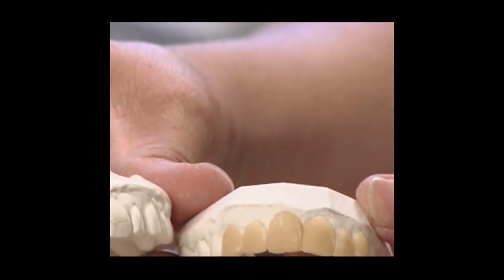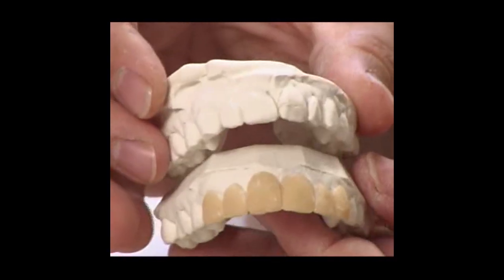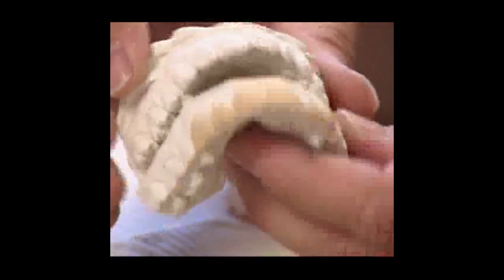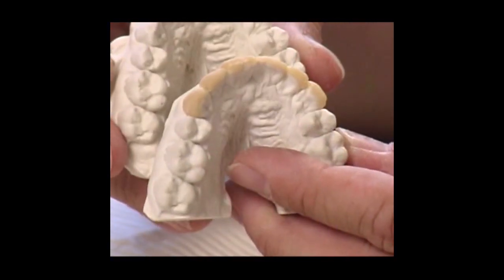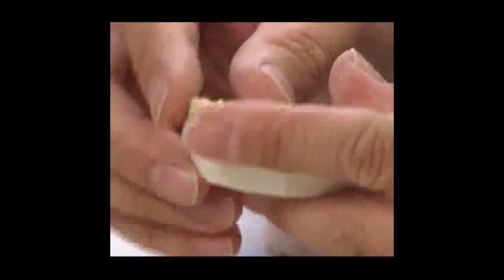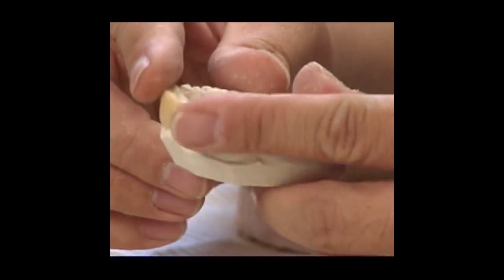So it's from here to here, as you can see. It's a little bit bigger, a little bit longer, but it's in an arc of what we wanted to achieve. Basically this way we can do it chairside and make the temporary very, very easy and quick.